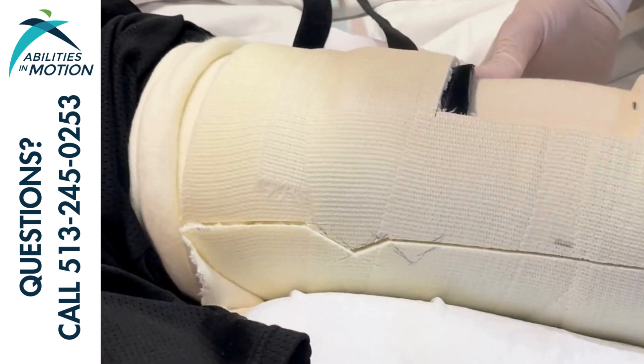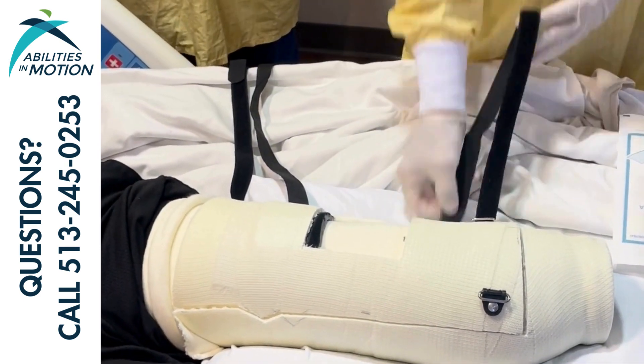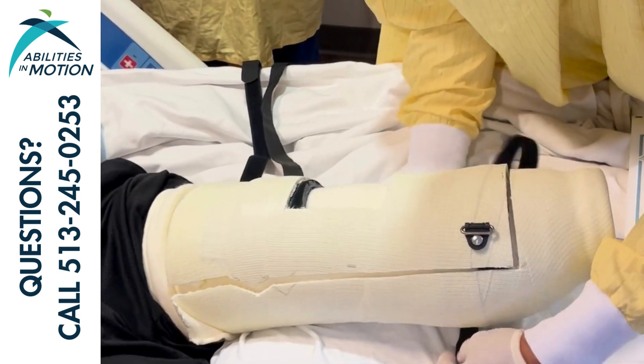What Tom is doing now, he's checking to make sure that the patient's kneecap was sitting right in the middle of the window that's been made for it in the lid of the cast.